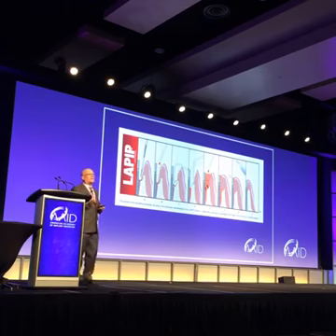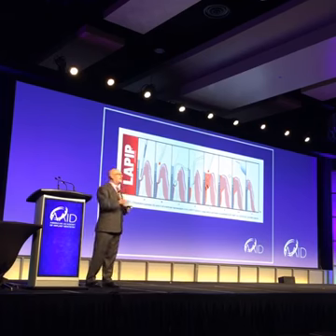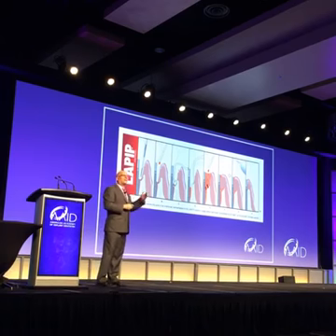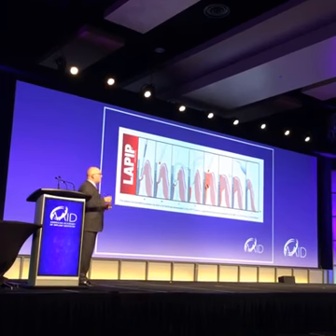You're going to get scatter of the photons inside the tissue, reflecting off the bone, etc., and that's going to break up and decontaminate the implant surface without directly touching it. Then we use our piezo scaler to flush things off. That also gives us the sonication effect to break up the biofilm on the implant surface. So we're using it to decontaminate, to clean out the surface, flush things off, and remove any cement near the implant above the interface.